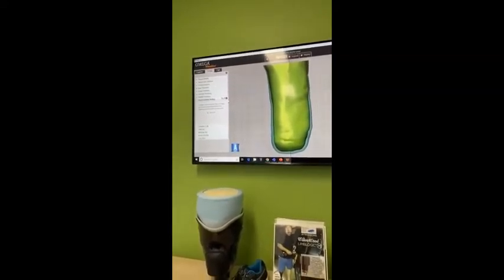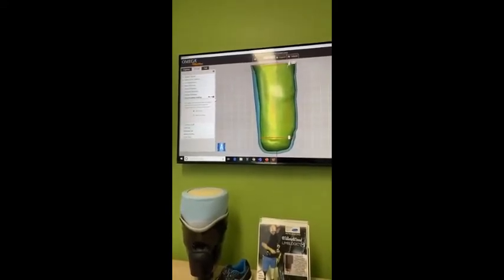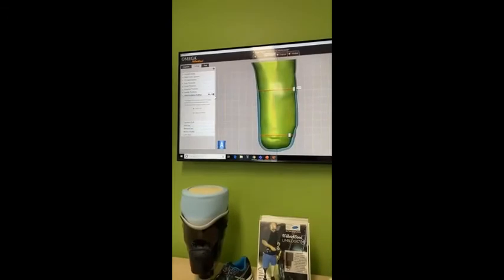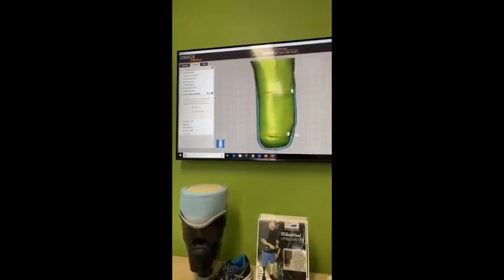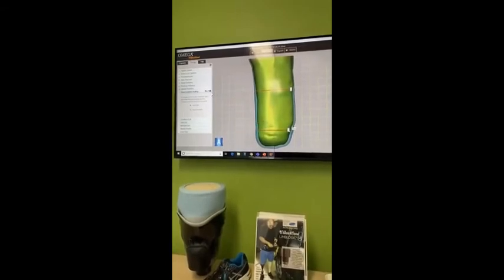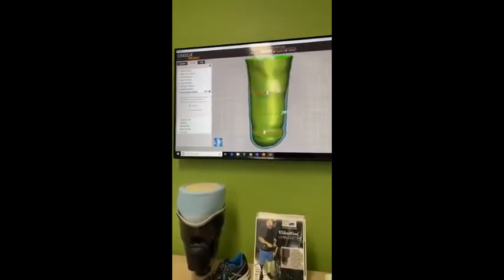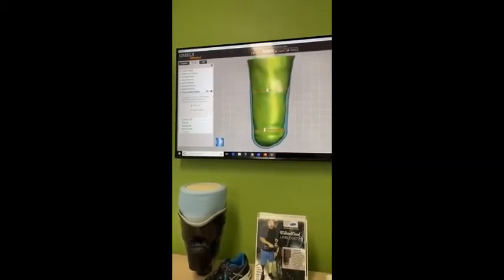And then this is this tick tool, it squares up a certain area for you. So I squared up this whole wall here and through here.